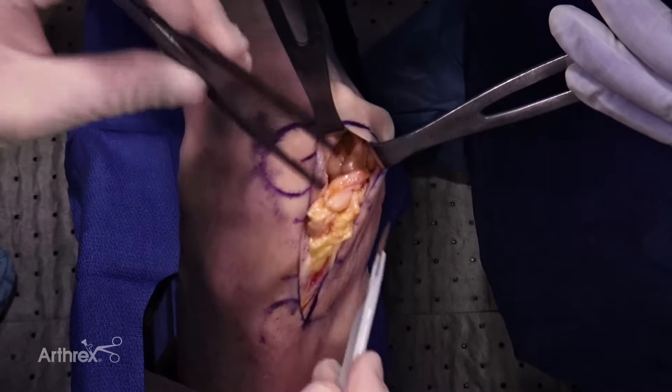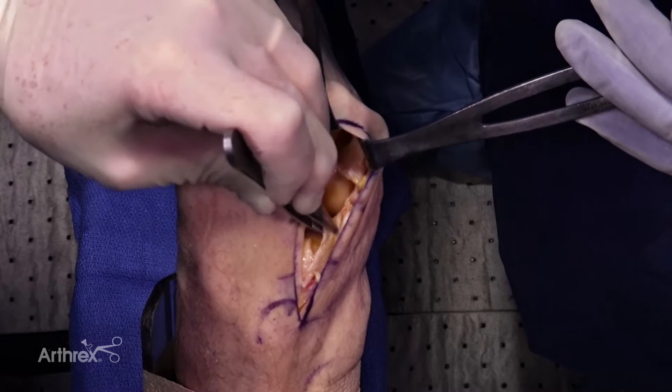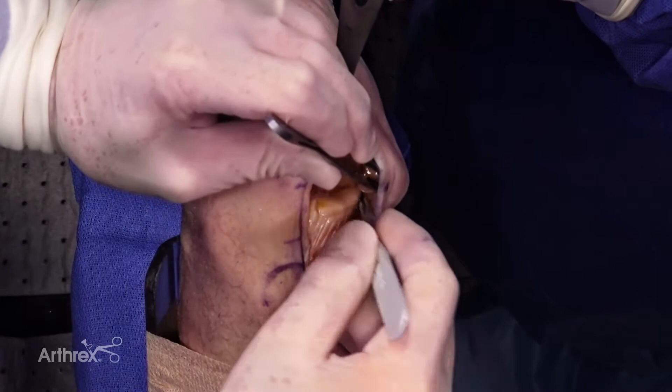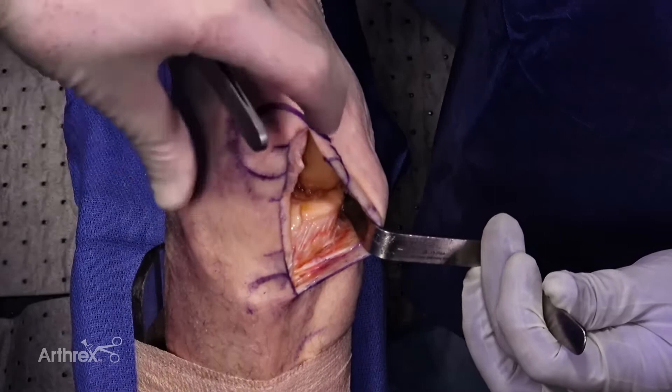At this point, there's a fat pad behind the patella that we just resect for visualization. Here's our joint capsule — you can see the femur. The patella is under here; the patellofemoral compartment is up there and we don't violate that. At this point, I grab the front edge of the meniscus cartilage, come out with that, stay right on the bone, and reflect the meniscus. I stay down about one centimeter below the joint line and come all the way around to the posterior medial corner. With the Z retractor, you can see easily the entire medial compartment with excellent visibility.